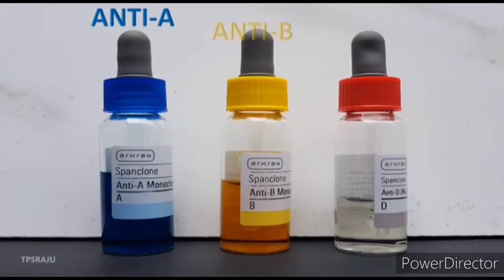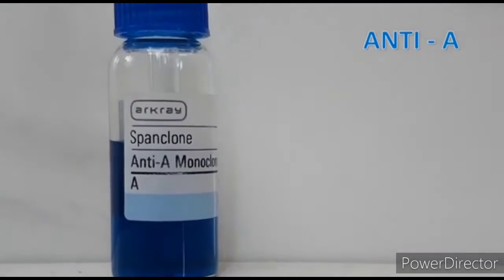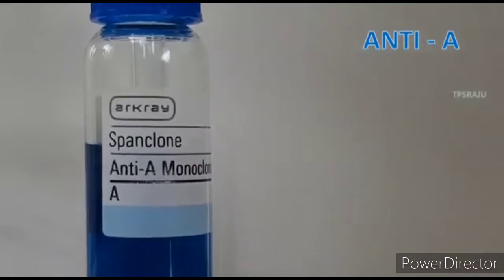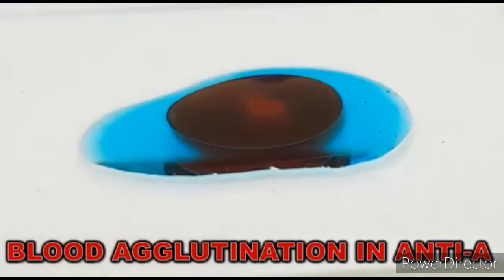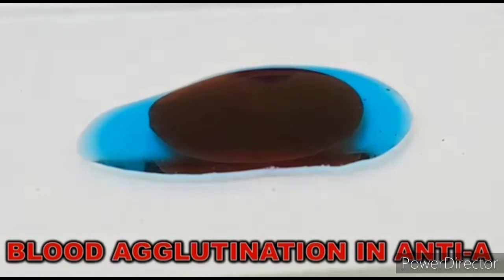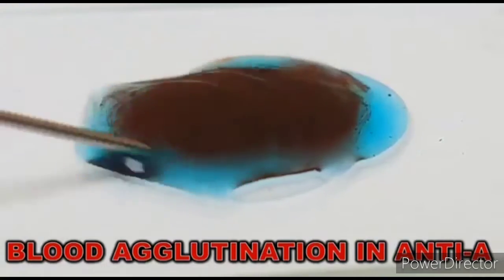Anti-A serum is responsible for the grouping of group A, which is blue in color. Let's see the identification of blood group A. Blood agglutination in anti-A serum, which is blue in color: just put a drop of blood into that. If the serum agglutinates the blood sample, then it is identified as group A.